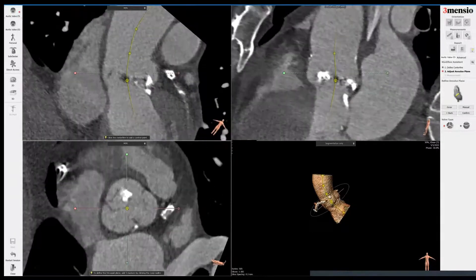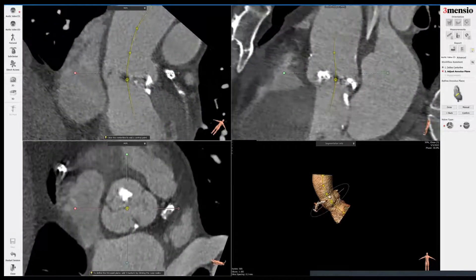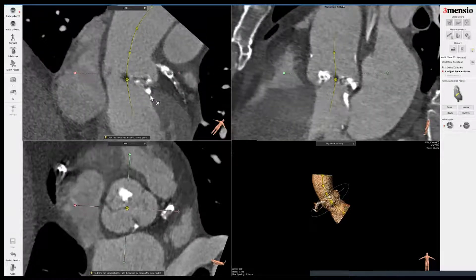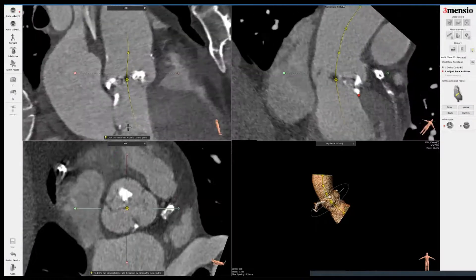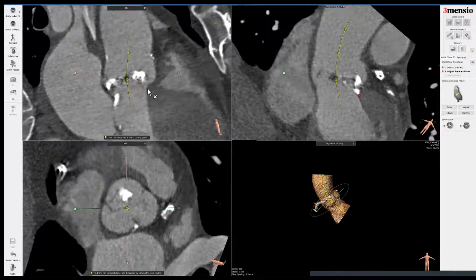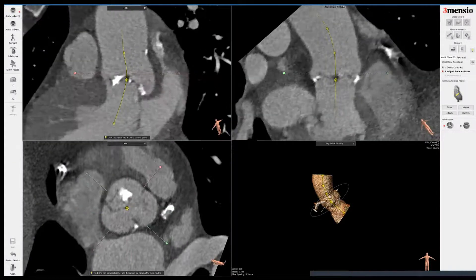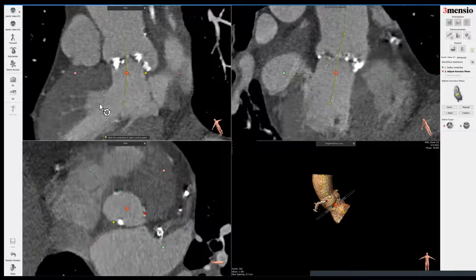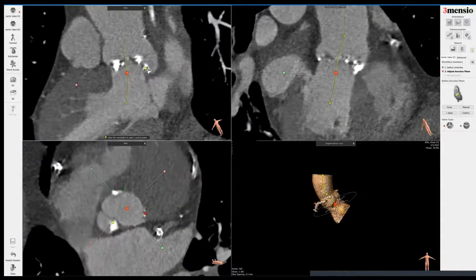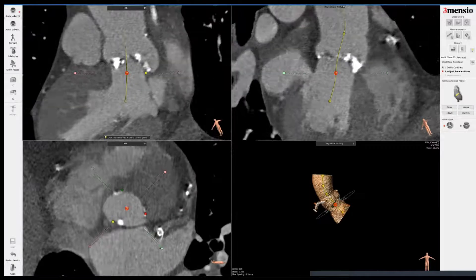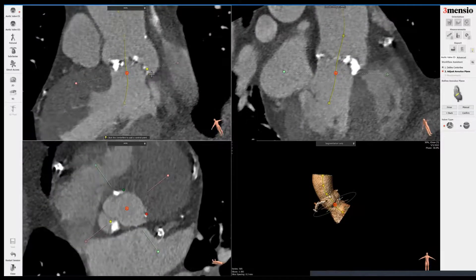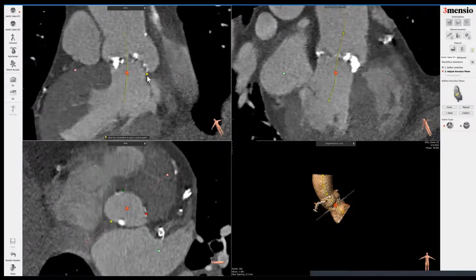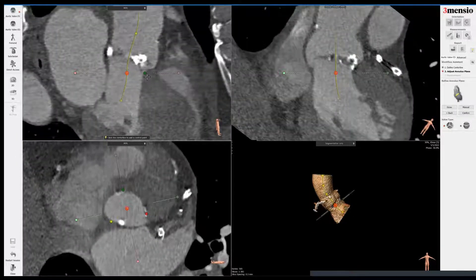In Sievers type 1, you're going to just go across the sinus with the open red circle and then put a red dot on the base of the left sinus. Then you do the same thing to the right sinus, and then the same thing with the non-sinus — very similar to a standard tricuspid valve. The only difference is that your dot distribution will be a little bit asymmetric because it is a bicuspid. Now you can see I'm a little bit off center in the non-cusp, so I'm going to rotate clockwise until the sinus disappears.